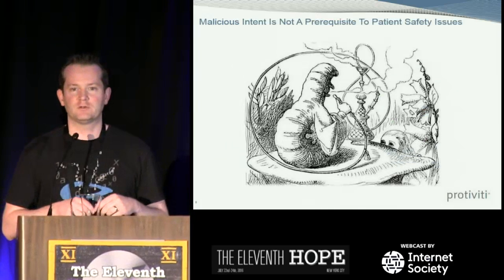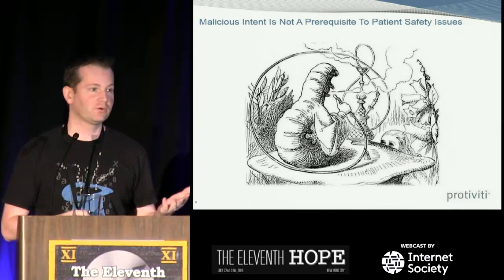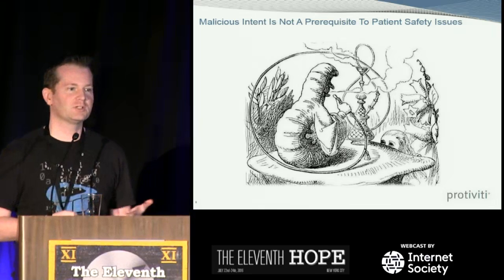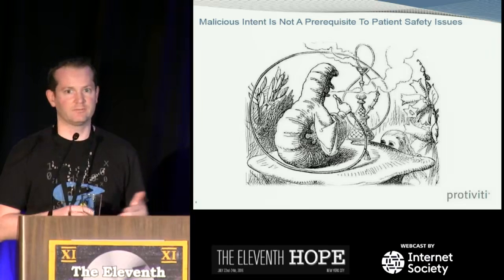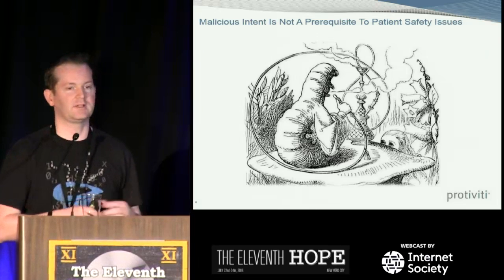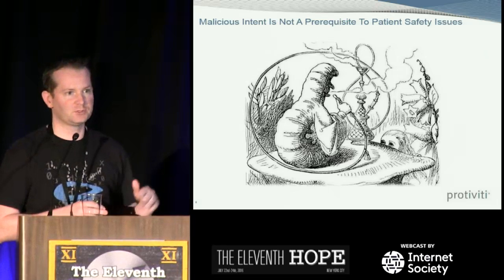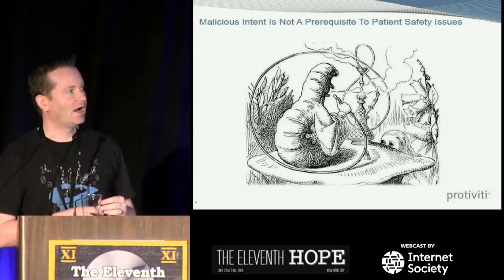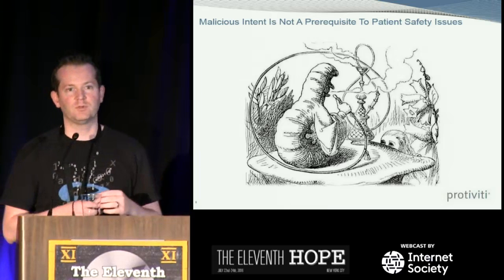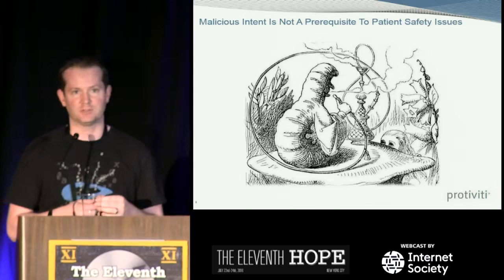One of the other things that we like to discuss when it comes to medical device security and vulnerabilities is, sometimes we'll get the question, well, who would actually do this? Who would actually try and attack a medical device and exploit it? Getting beyond the fact that people do crazy things and we shouldn't rely on trusting the internet, one key point is that malicious intent is not a prerequisite to a patient safety issue.